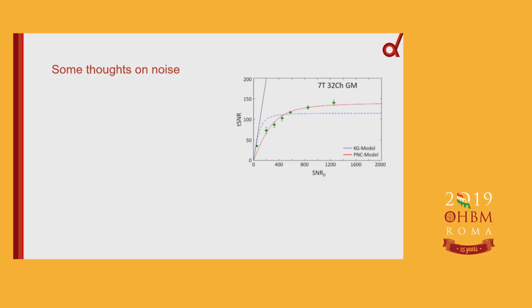This is a spontaneous question. Who already knew this? Okay, for those that didn't, which seems to be the bulk of people here, that basically means that the thermal noise is not important. It means that your time course noise is dominated by physiological variation. Either it's the intrinsic variation in the BOLD, or it's respiration, or it's something cardiac. But basically, that physiological noise is proportional to the signal.